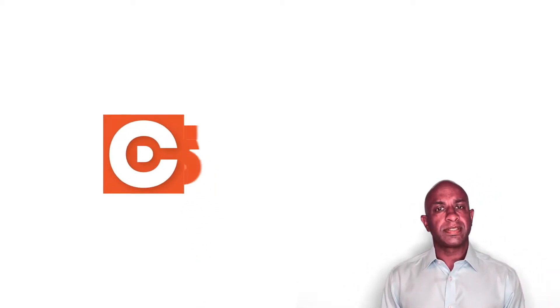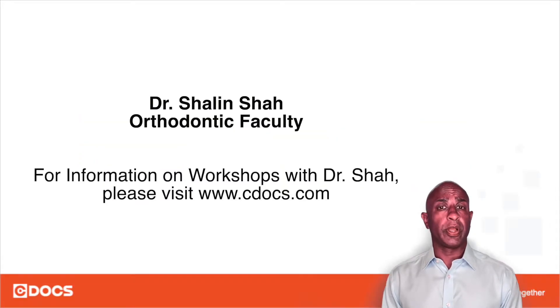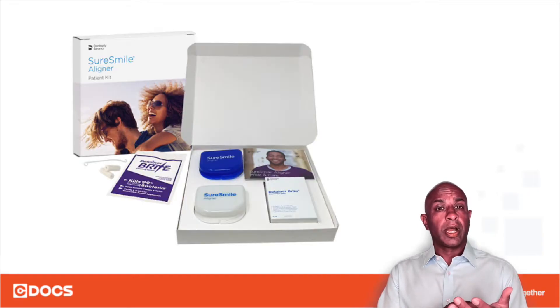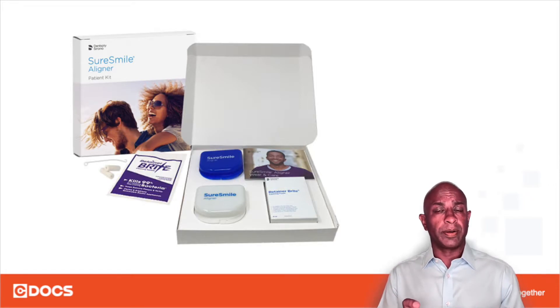This is Shaleen from SeaDocs Ortho. In this tip of the day we're going to talk about loading the attachment wells that come with the SureSmile attachment templates. In your SureSmile packaging you will see that there is one bag labeled attachment templates. You want to remove those attachment templates, and any teeth that require an attachment will have a negative well for that attachment and the design that is to be placed.